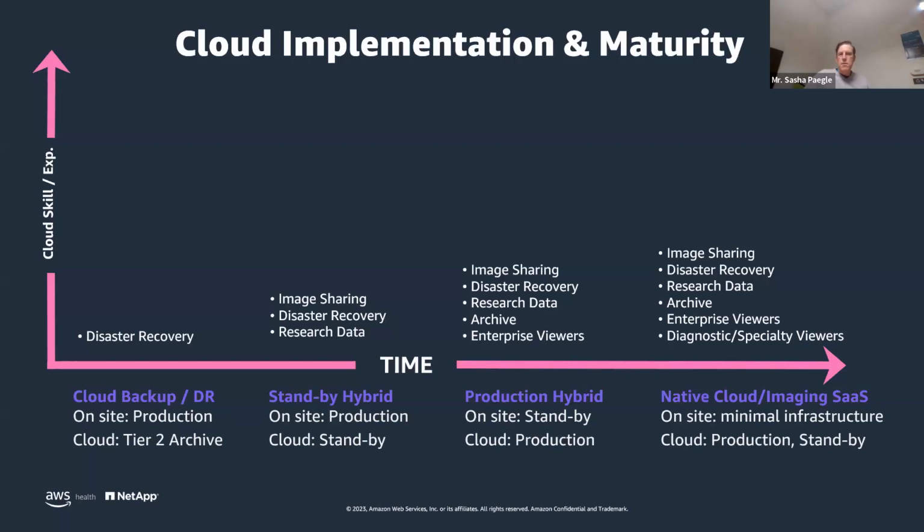Initially, you may continue to depend on all your on-premise infrastructure as your primary source to deliver an imaging solution, and the cloud is a standby as a just in case. Over time, that may flip. It may be that you're all in the cloud, and your standby system might be on-prem, and that might be for business continuity purposes.